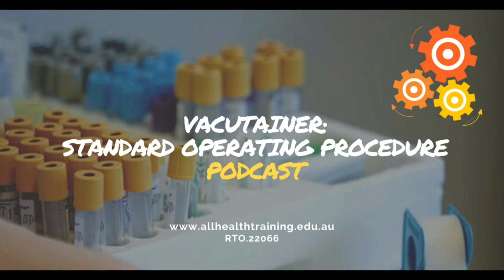Tidy up your workstation. Complete the referral, ensuring that barcodes and the day sheet are completed. Place the referral in the front pocket of the biohazard bag with the tubes. You can now remove your gloves and sanitize your hands. Place your bloods with the referral into the processing area, and now wash your hands with soap and water.